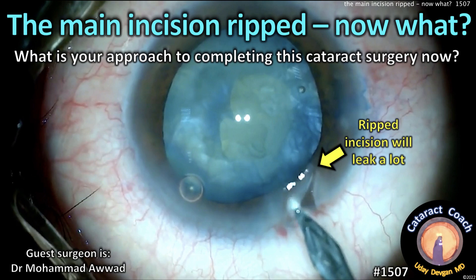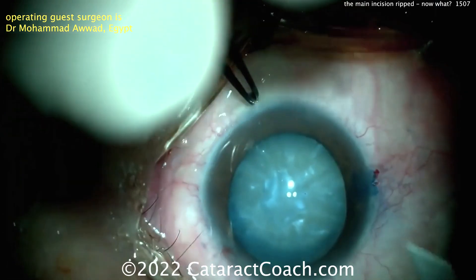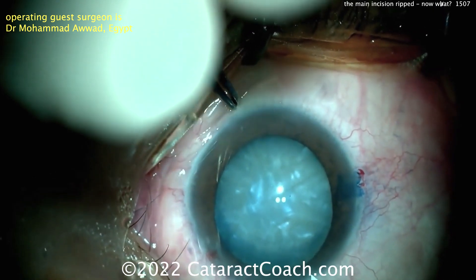CataractCoach.com. The main incision ripped. Now what do you do? What's your approach to completing this cataract surgery with that ripped incision? It's going to leak a lot. Let me show you the incision here.